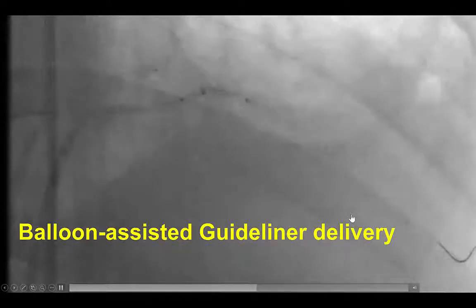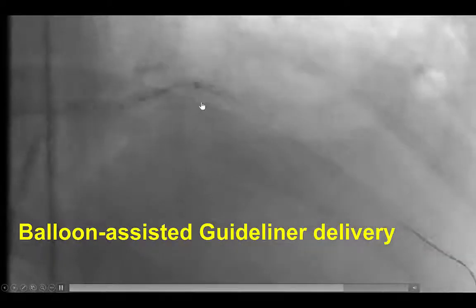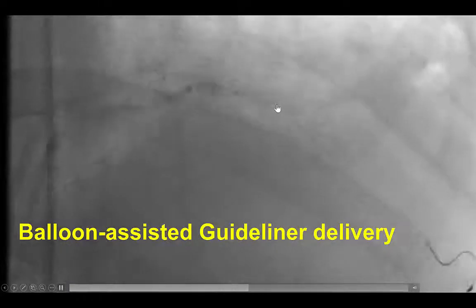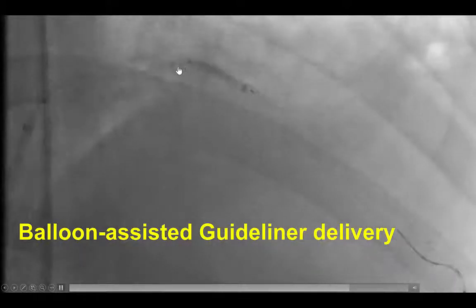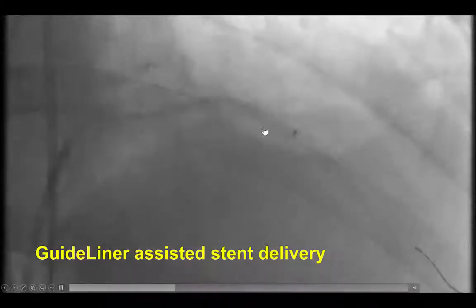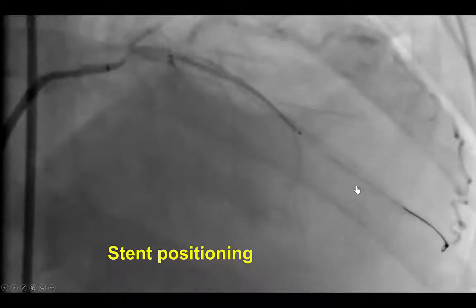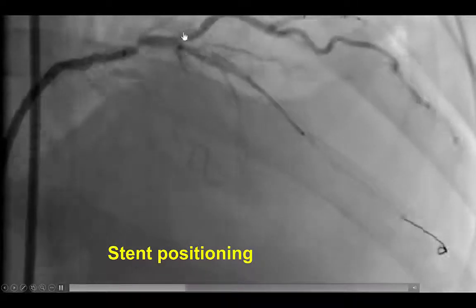Stent delivery was extremely challenging, and that is why we decided to use the Guideliner. The Guideliner was difficult to advance, so we used the balloon-assisted technique: a balloon was inflated halfway in and halfway out of the Guideliner, and when deflated, the Guideliner was advanced over the balloon further down into the vessel. This was repeated several times until the Guideliner went past its proximal bend and all the way into the mid-LAD at the target lesion. After that, it was fairly easy to advance a long 38 mm drug-eluting stent all the way to the mid-LAD, carefully positioned to avoid covering the ostium of a fairly large diagonal branch that had some ostial lesion.